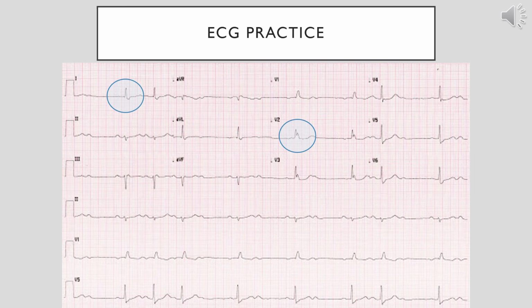As far as, is this going to be a lethal arrhythmia? This could definitely worsen, and the patient probably needs a pacemaker. When you're looking at Mobitz 1 versus Mobitz 2, Mobitz 2 patients generally need intervention at a sooner time compared to Mobitz 1. And a pacemaker may be necessary, maybe temporary pacing, but that's something that cardiology would need to decide.